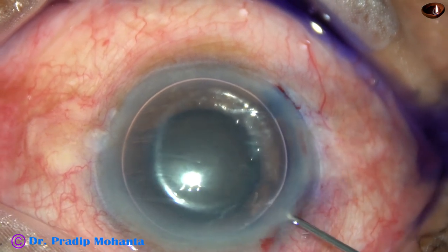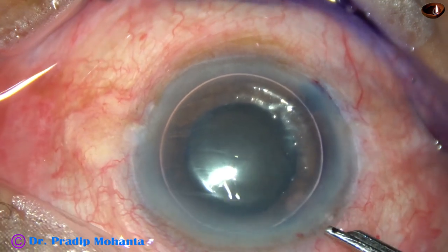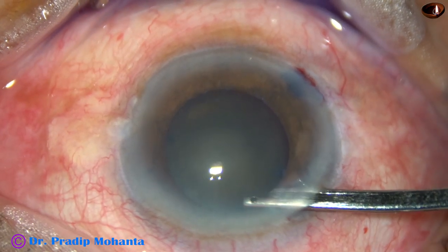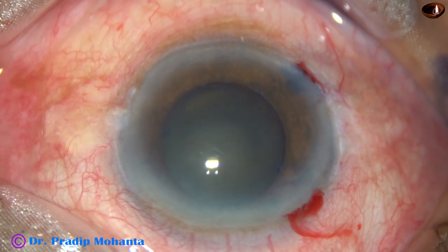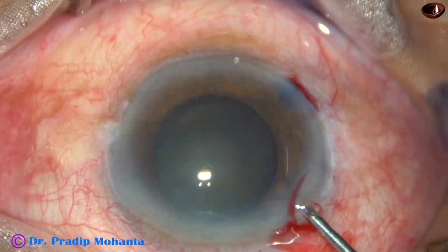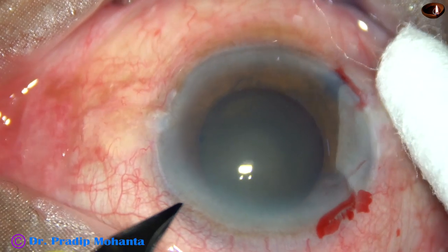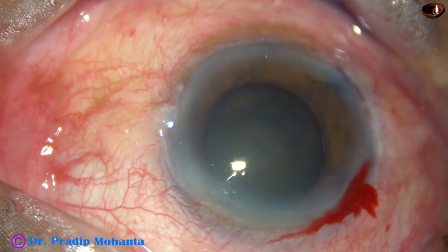The dye stains the capsule immediately if you use an air bubble. A little bit of adrenaline has been used, and now the dye is nicely washed out. Now 2% hydroxypropylmethylcellulose is injected into the anterior chamber. The anterior chamber is filled up with this visco, and now one more side port is made on the left side of the main incision, about 2 and a half o'clock hours away.